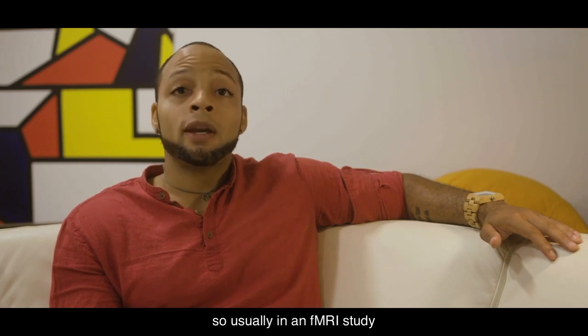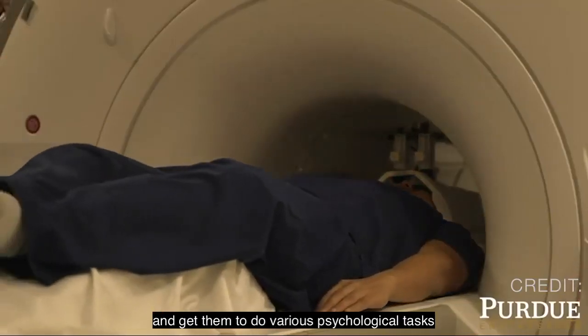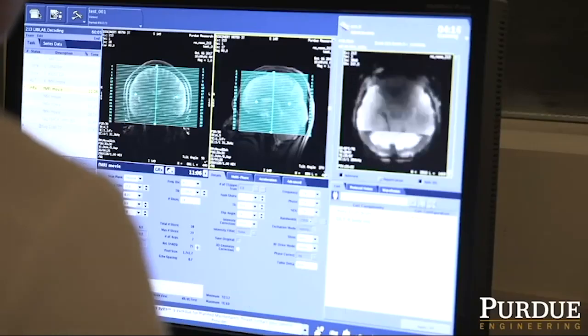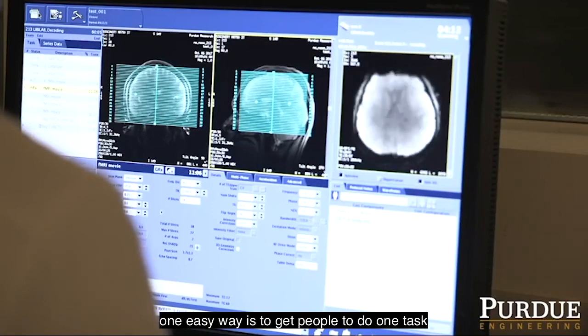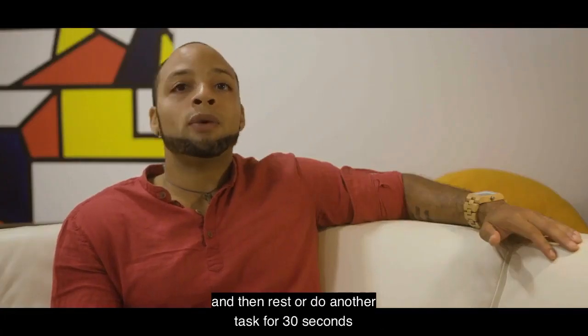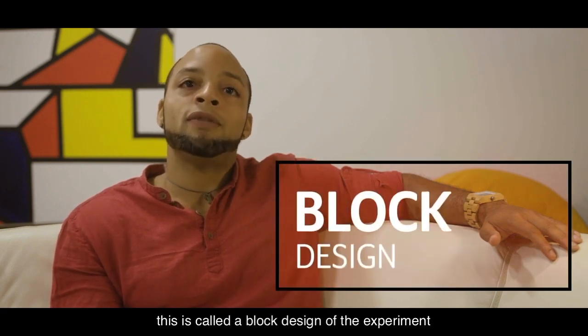So usually, in an fMRI study, we put people inside the scanner and get them to do various psychological tasks like watching a movie or counting numbers backwards. Because the BOLD signal is sluggish, one easy way is to get people to do one task for 30 seconds or so, and then rest or do another task for 30 seconds. This is called a block design of the experiment.